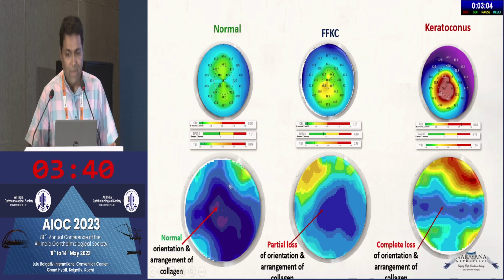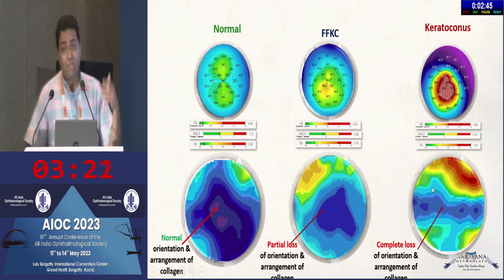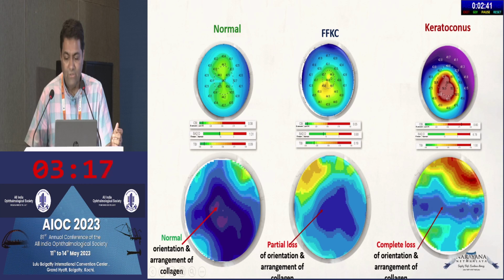The checkered pattern is perfect and the peripheral fibers are healthy. In a suspect case, you can see that this lighter turquoise blue means that you have lost the collagen there, and there's only a central island left, and the peripheral anchoring fibers are also weaker. And for every grade of keratoconus, irrespective of grade on your topography, you have different functions on the corneal plane.